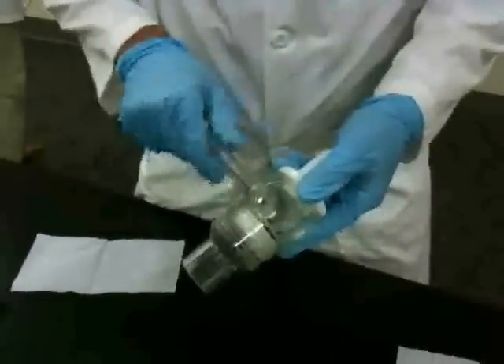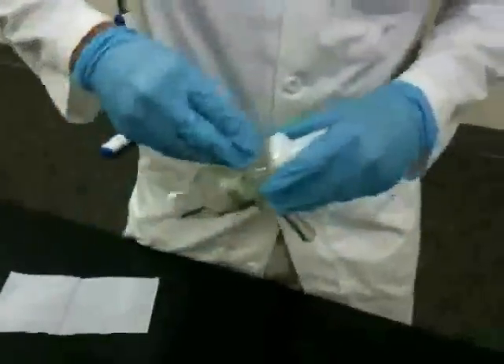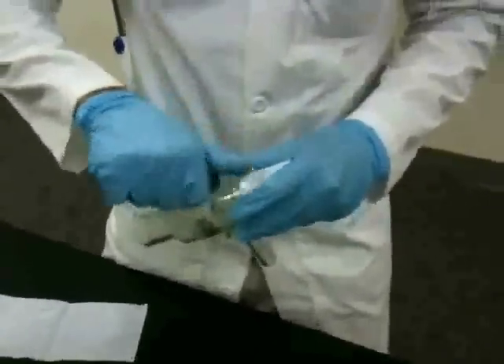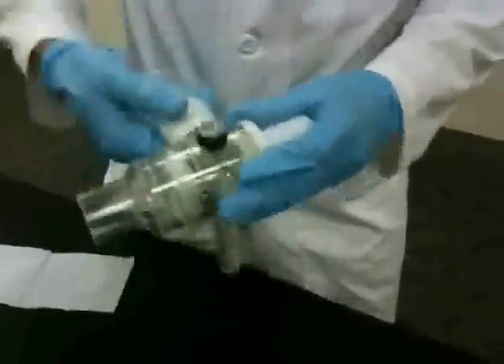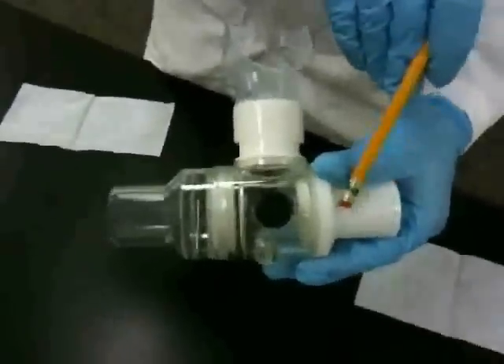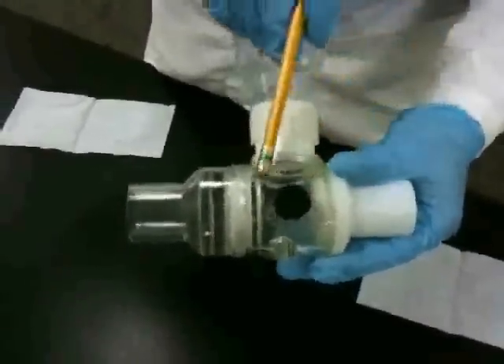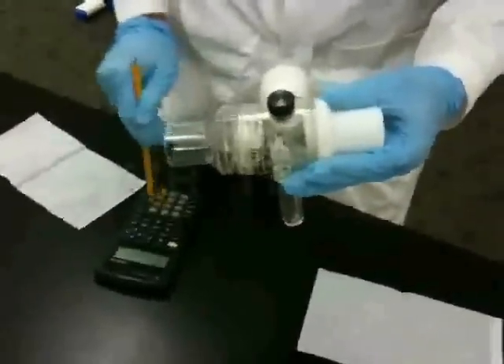The exhalation port gets tightened on. Spit catch for the saliva. The cap. And the mouthpiece. Notice the path in which air is flowing through the inhalation port and out through the exhalation port into gas collection. Remember to do some last-minute calculations and make sure everything is air-tight.